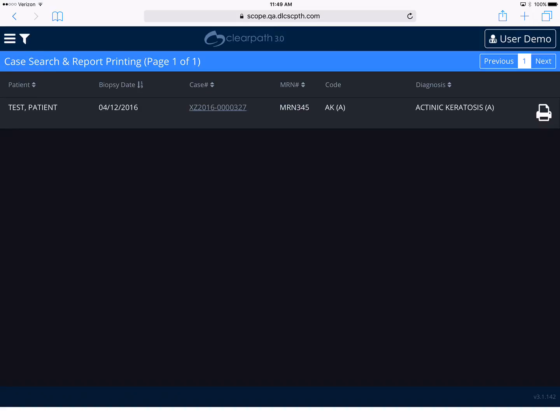If you go back, you can see that you can print the report again if needed, and it has just high-level information. You can also use all of your search and filter criteria that we had gone through previously in this same queue. So that was a quick demo of how to do a diagnosis from a standard perspective. Next, I'm going to create a video on how to do a diagnosis if you don't find the diagnosis that you're looking for in your list.